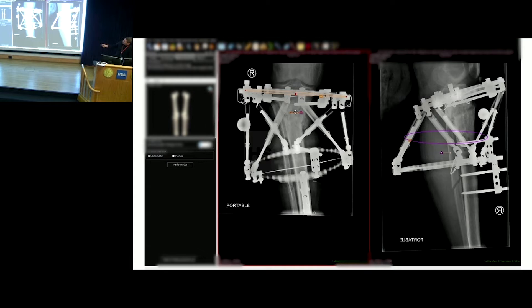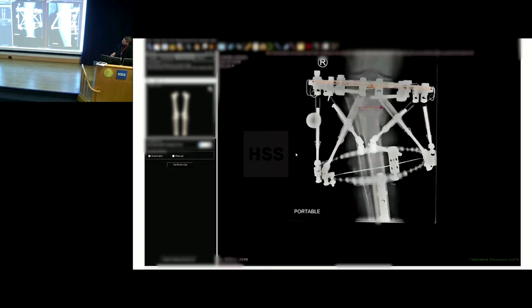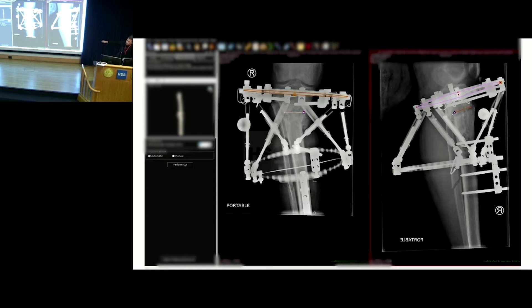They're telling me this is our proximal reference ring — you basically make it superimposed. This is the osteotomy site. You do it on the AP; it's sort of fun — you swing it, make it a little smaller, superimpose it. This is the master tab. Remember the master tab if you use the TSF. Aligning the master tab here, master tab there, jiggling it. Now TraumaCad knows where the reference ring is, where the osteotomy is, and the orientation of the master tab.